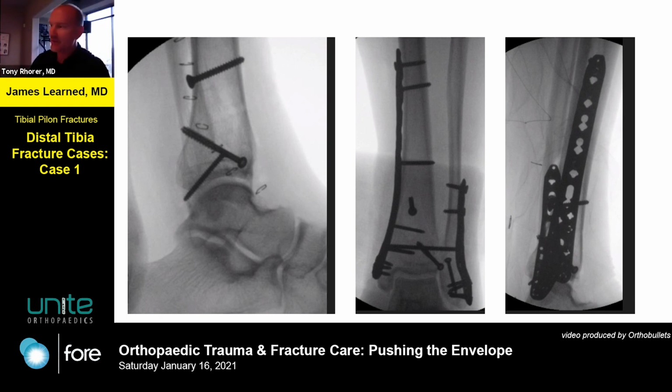The other thing about the external fixator is that it's serving two purposes. One is to get the bone out to length, but it's also supposed to be a soft tissue rester. And if you don't have a really stable construct, again, why I hate the delta frame, you're not resting the tissue, because the calcaneus will spin around that pin pretty easily. And so the foot is flopping around and the ankle's flopping around. You'll see people in delta frames for 3 weeks still with fracture blisters, and I think that's the reason why that happens.